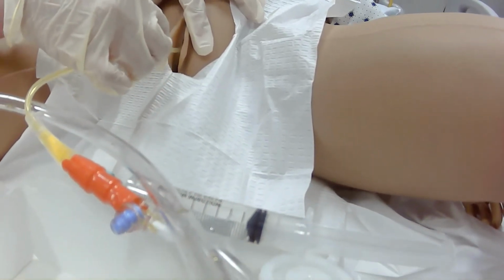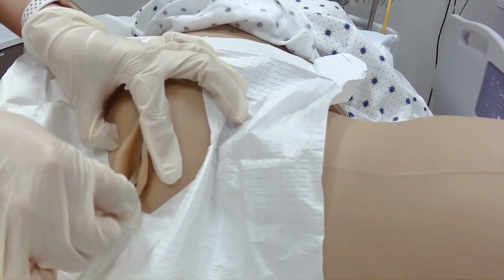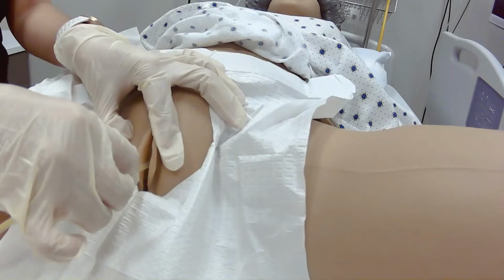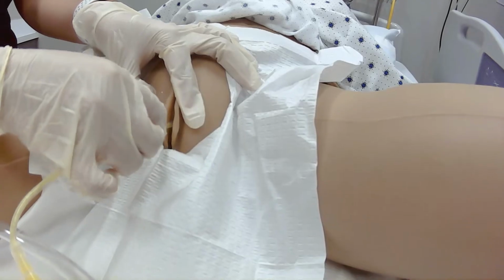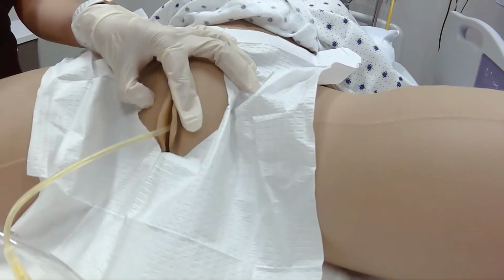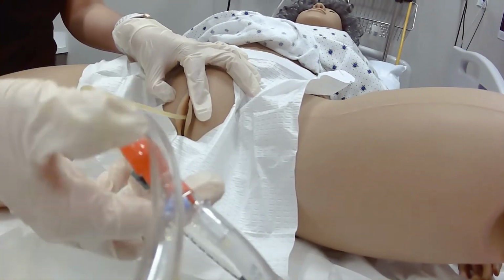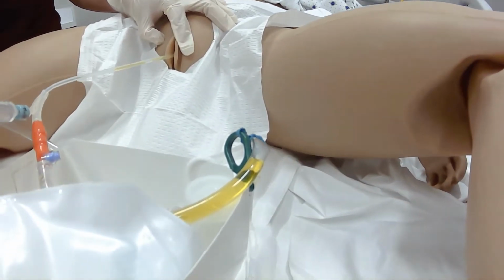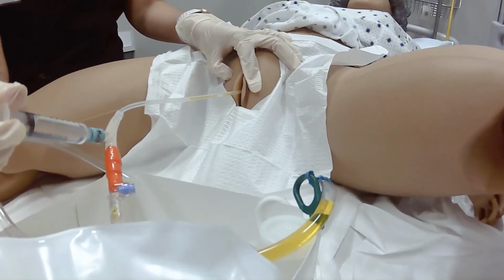Okay, so once I see the urine return, I'm going to insert 1 to 2 inches more to make sure that I am truly in the bladder. Okay, because I could be right in the urethra, right near the bladder, but I'm not truly in the bladder. So once I've inserted 1 to 2 inches past the point of seeing that urine return, I am going to get my syringe here, and I'm going to inflate that catheter balloon. Okay, so we're going to inflate by pushing in that plunger.